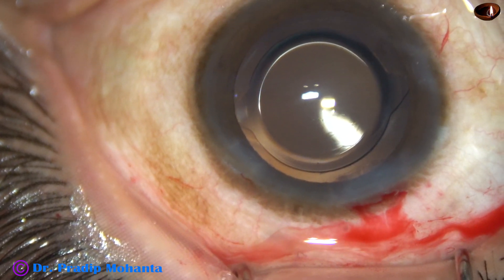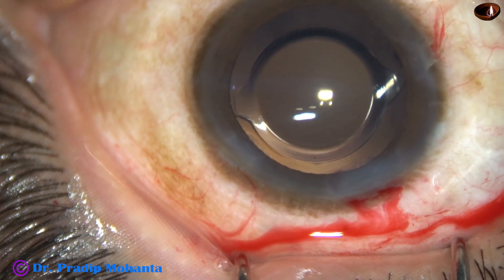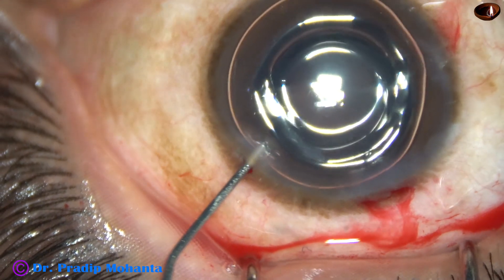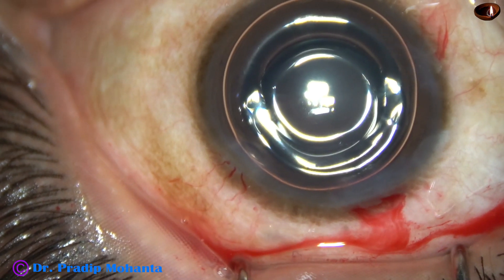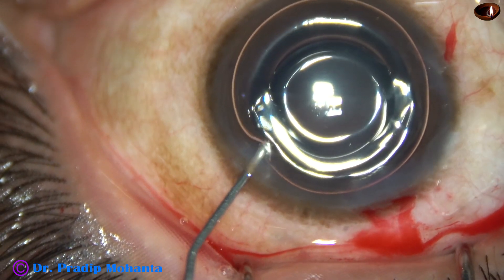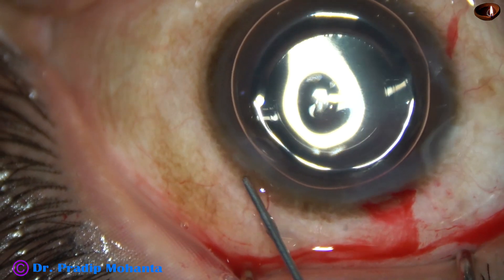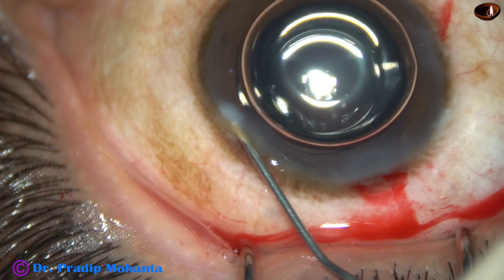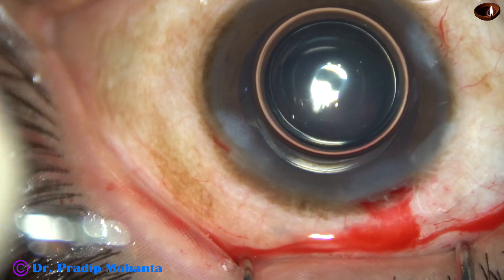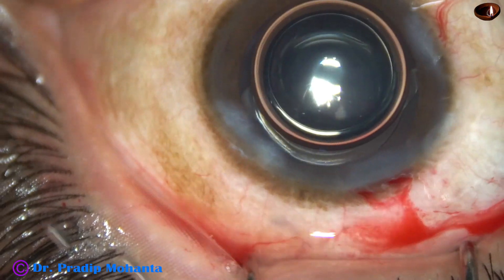Whenever we use bi-manual and if the side ports are small, a lot of fluid comes out and the anterior chamber becomes almost flat. So it is a good idea to inject an air bubble and maintain the depth of the anterior chamber. Now hydrate the corneal stroma on either side of these stab wounds so the side ports get closed.